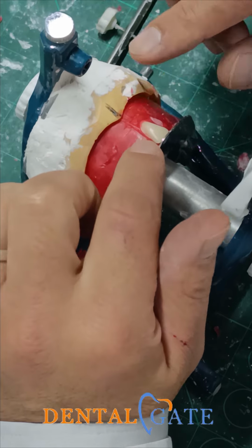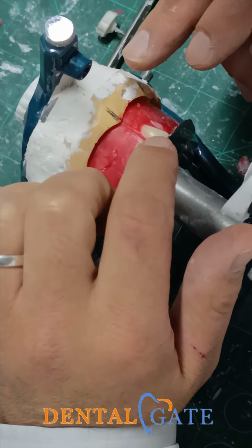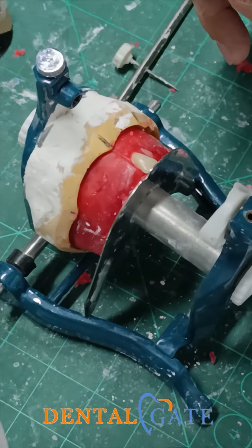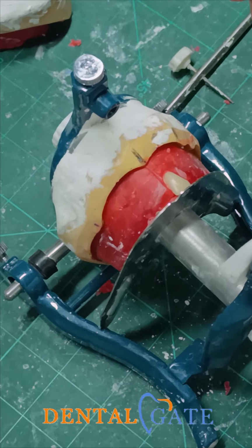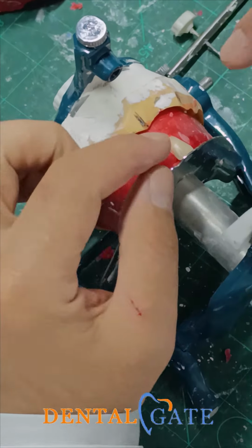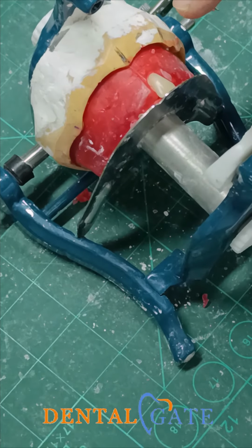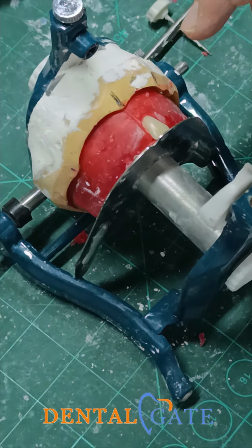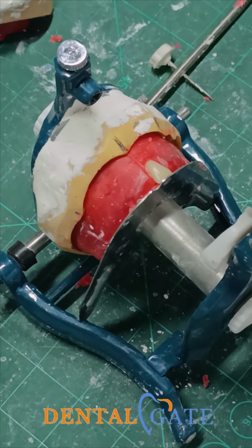These criteria will be performed in accordance with the balanced occlusion criteria, because I want the compensating curve and the curve of Wilson to be produced within this law, okay? We have two laws, for the lower or the upper. If you make the upper on the table to this criteria until you reach the posterior, it is perfect.